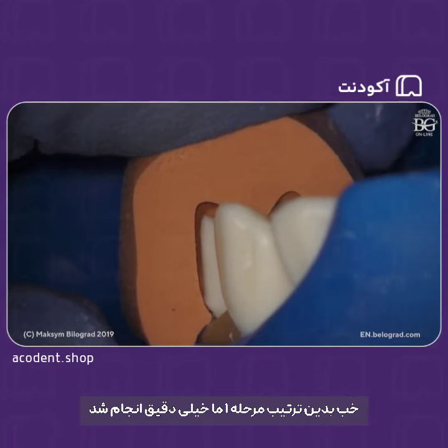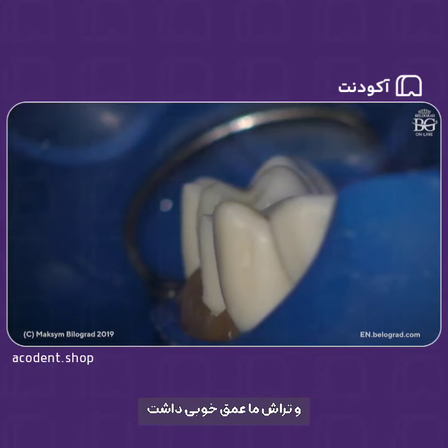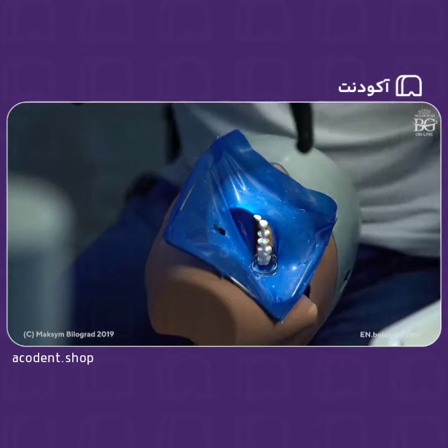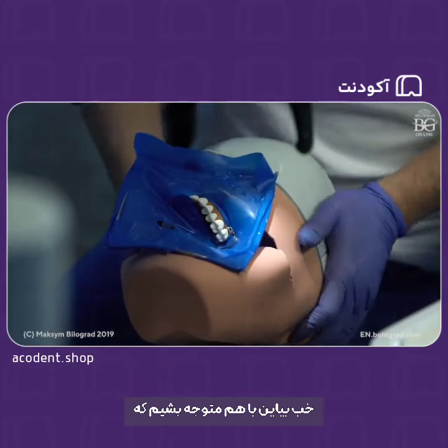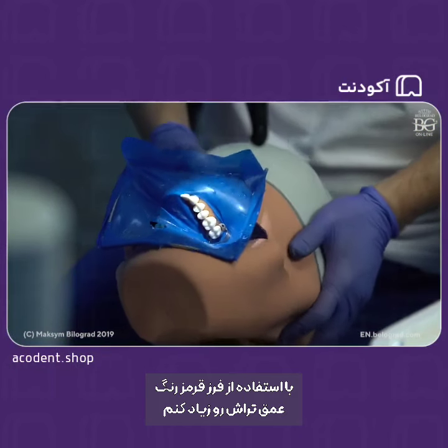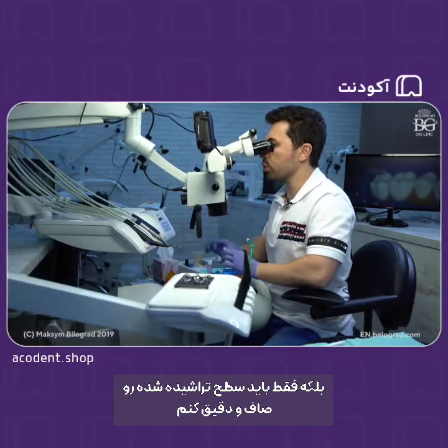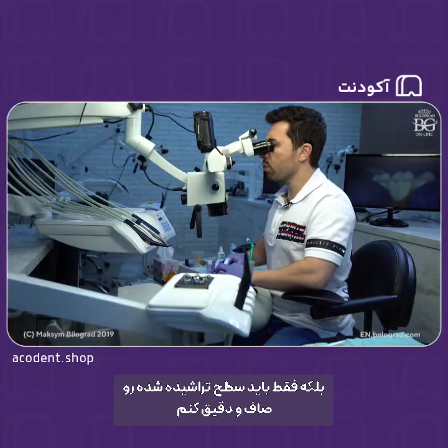So basically stage 1 was performed pretty precisely in terms of depth of preparation. That's fine. So what does that mean? During my second stage of preparation with the red burr, I don't need to increase the depth of preparation. I just need to make my preps smoother and more precise.